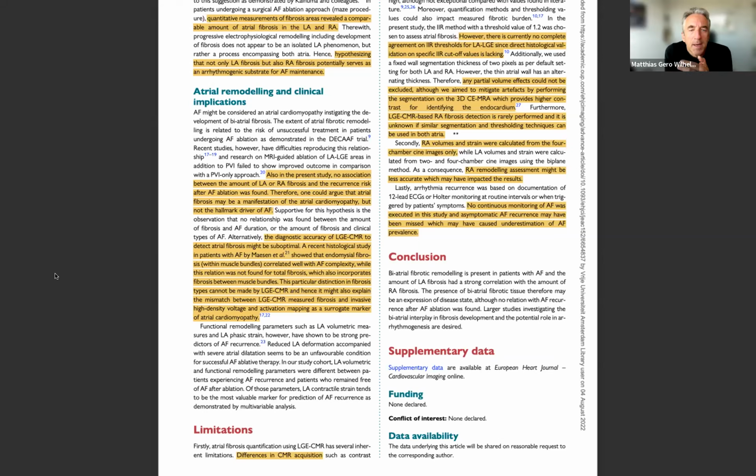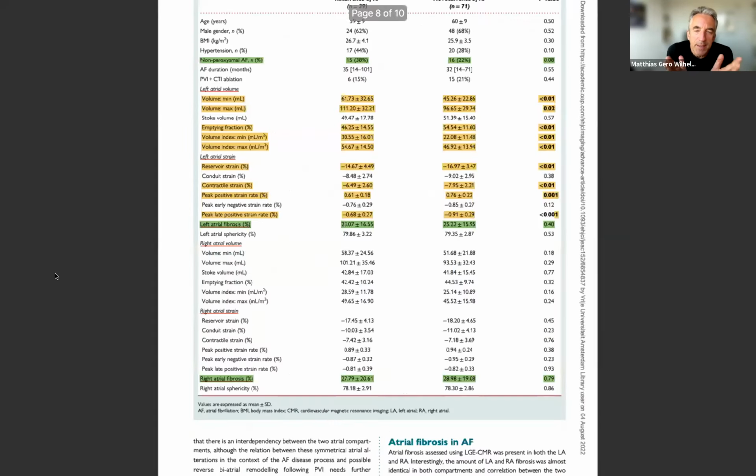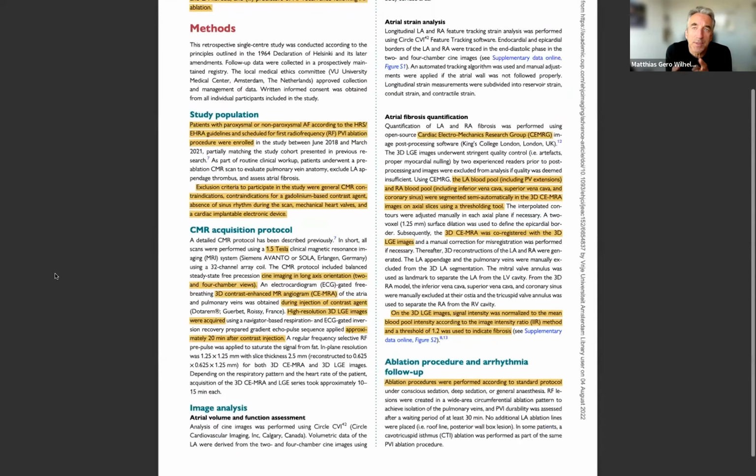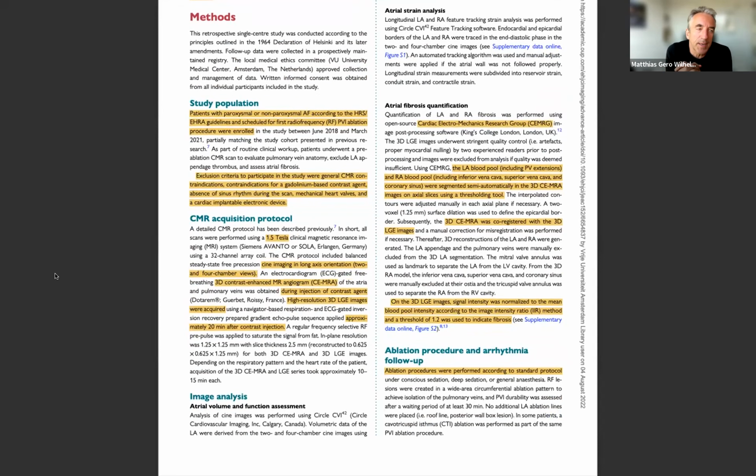Okay. And then what was the CMR protocol for late gadolinium enhancement images in the left atrium? Because we know that, for example, the inversion times are different for the right ventricle and the left ventricle, partially due to the thin wall, but that may also relate to the atrium. So the protocol, is it in the paper, so we can just refer to that? Yeah, we obtained a 3D volume. So it's the same inversion time for both the left and right atrium, but it would be interesting to check that. Okay, thank you very much, both of you.